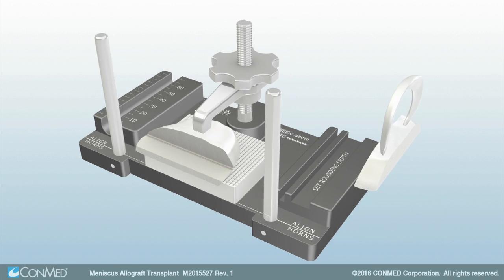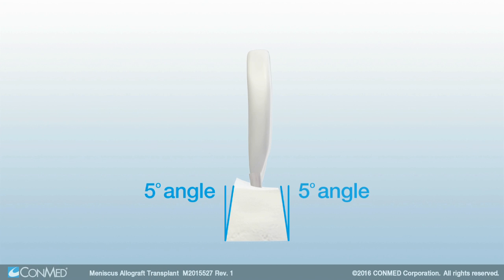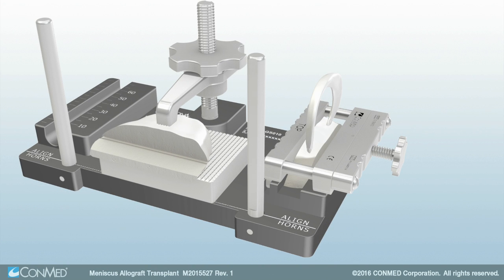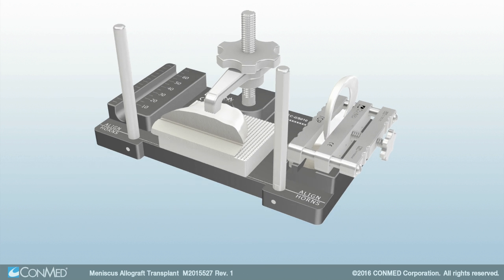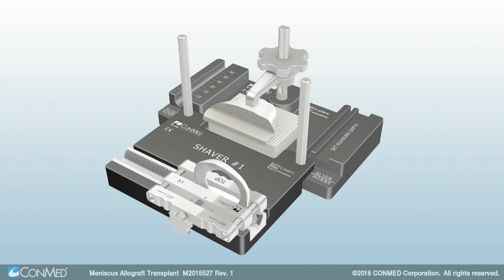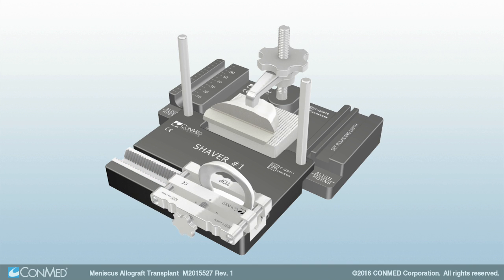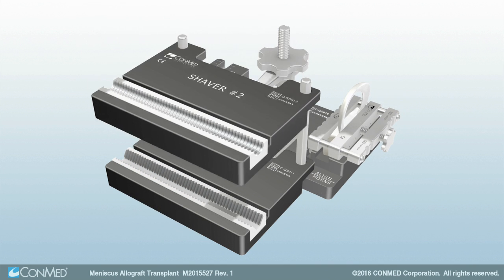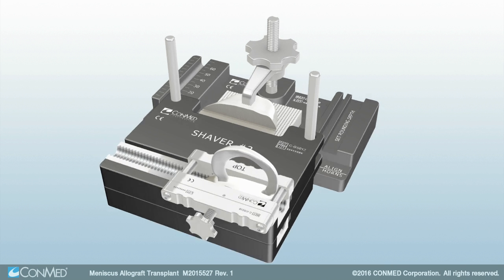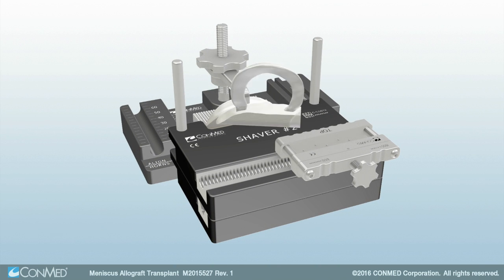The 10-degree all-included angle helps prevent vertical lift of the bone block within the tibial trough. Place the allograft into the depth setting guide and seat the shaver clamp over the bone block. Tighten the clamp to secure the allograft. Next, place shaver No. 1 over the guideposts and gently shave the allograft until the bone block slides smoothly over the shaver. Then place shaver No. 2 over the guideposts and repeat the shaving process. Once complete, confirm the allograft shape by placing the bone block into the rounded trial slot.